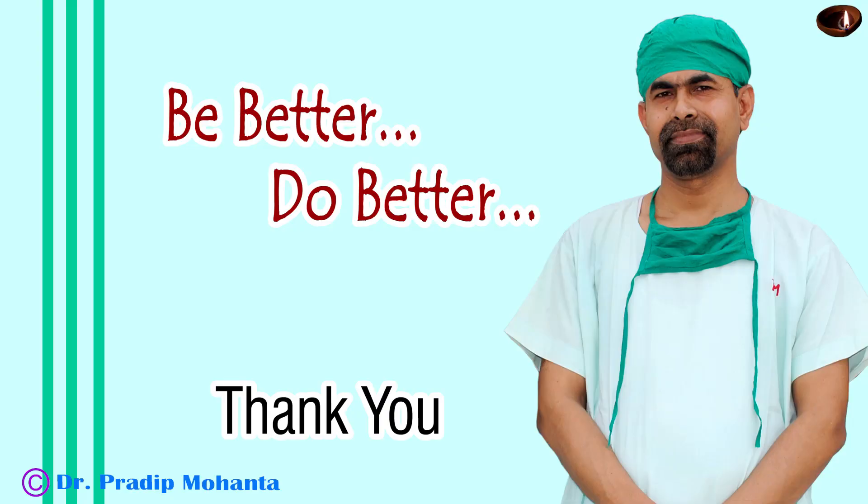Thank you very much for your attention. Hope this video will help you in developing your surgical skills. Be a great surgeon and serve your patients with love, respect, empathy, and great surgical competence.